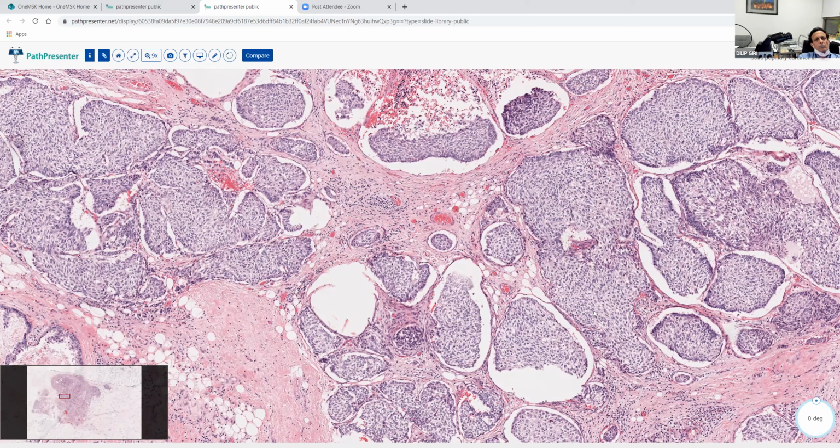Now, by definition, encapsulated papillary carcinomas are low grade. Okay. And that is why it's probably okay to treat them as DCIS. In the literature, there is at least one study that I am aware of where they have come out with the term high-grade encapsulated papillary carcinoma.